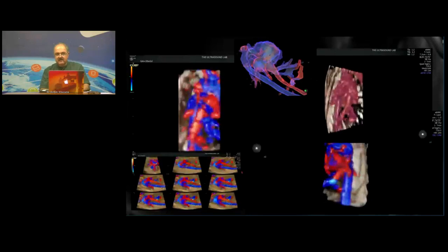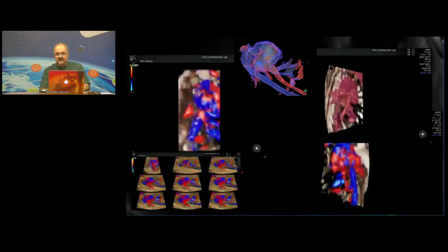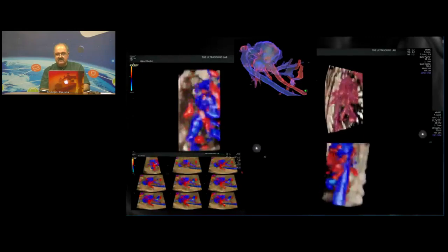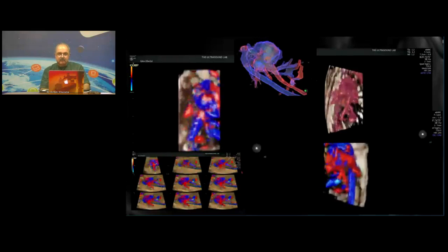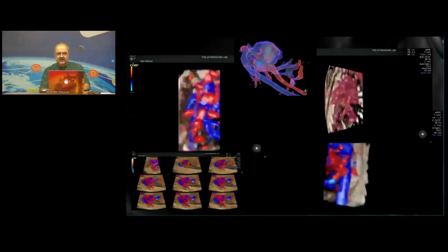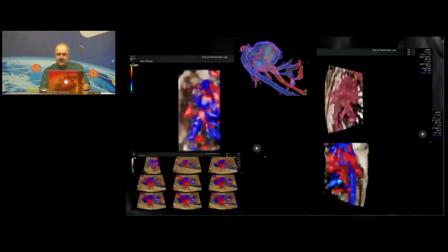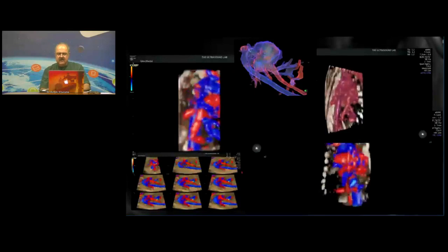with the thickness, move on to a silhouette mode or an outline mode, and pick up vessels like this, as you see here. Look how beautifully you pick up the vena cava, the ductus venosus, and so on, the arch of the aorta, all as individuals, and you see through and through. You're actually able to see all these vessels so neatly and cleanly by turning a single button and getting this information. We were struggling with this information with the old technology.